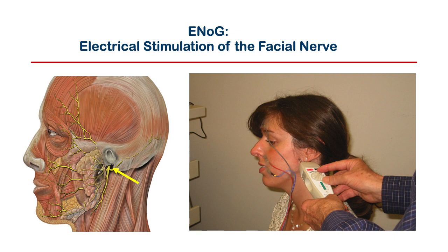All right, so here I am stimulating. This is actually an audiologist who's in Florida, but she was an extern when I was at the University of Florida, and so she said, "Oh yeah, I'll be happy to be a subject." So I'm stimulating. There's two little prongs at the end of that stimulation device, and I'm controlling a little knob there that's the intensity level of the stimulus. And I start at maybe 5 milliamps, and I go up to 10, record a response, go up to 15, get a response, and I keep going until the response doesn't get any bigger. And if I have to go up to 40 milliamps, that's the maximum, I'll do it.